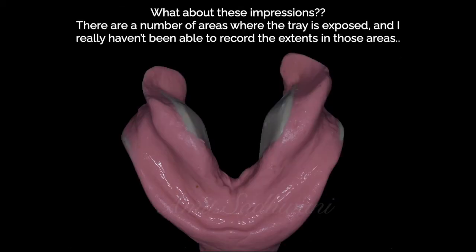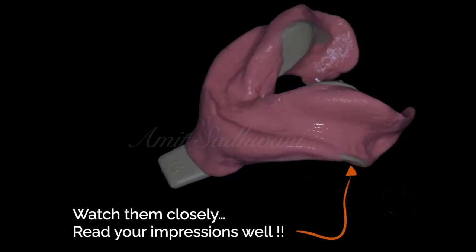But what about this impression? There are a number of areas where the tray is exposed, and I really haven't been able to record the extent in those areas. Would you want to see them closely? Watch it. You need to read your impressions well.